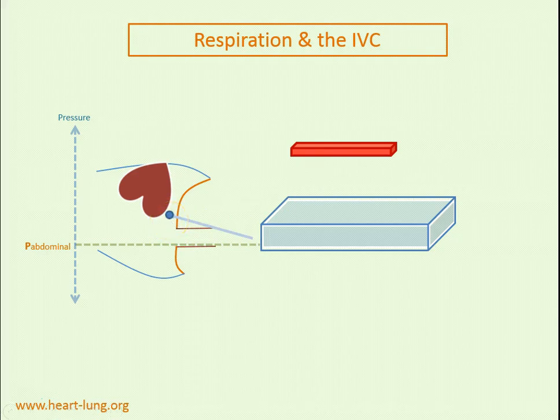So in patients who are completely passive with the ventilator, and in some of the IVC papers, particularly, I believe, the one by Barbier in 2004 and Feissel as well, they were looking at IVC dilation. That was in a patient population that was essentially paralyzed, not making inspiratory efforts, and they were also receiving relatively high volumes on the ventilator, I believe 8, 10, 12 cc's per kilogram.